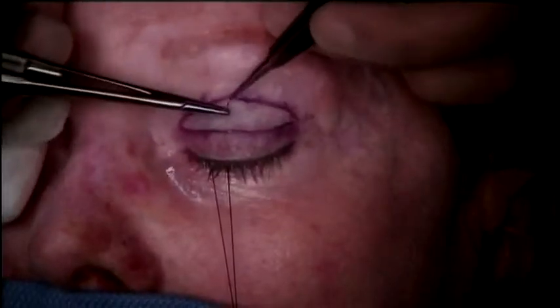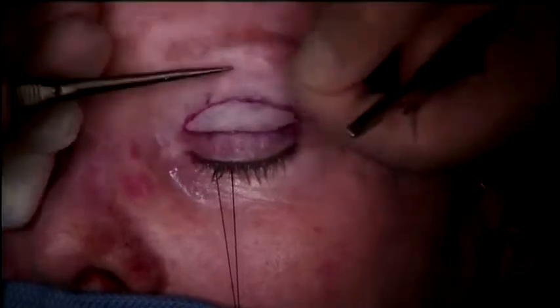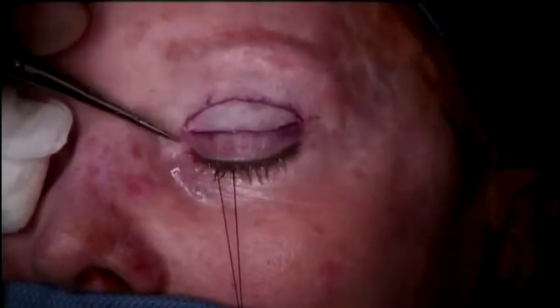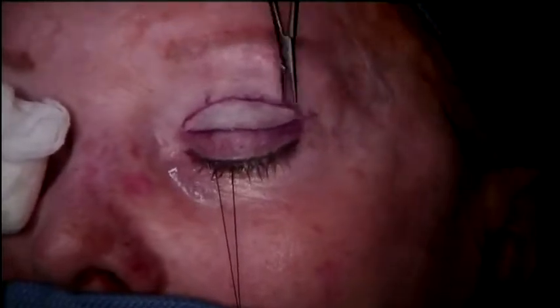And now you have several options for this. I typically use a 7-0 vicryl to anchor these at the edges, and you can go ahead and do a running pass through it. Once the corners are anchored in position, you can just run the suture.